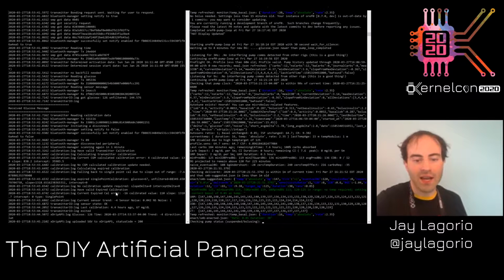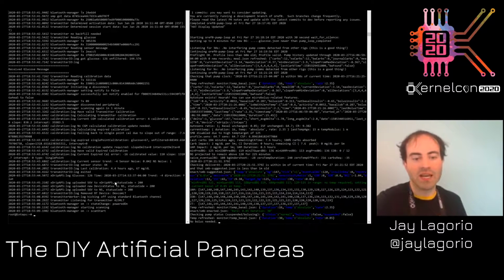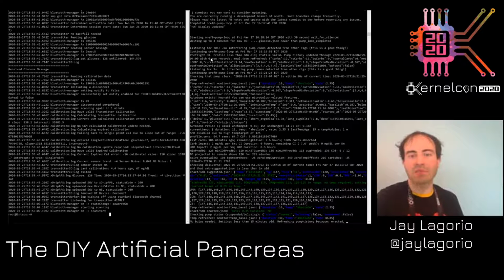And then right about here, uploading it to OpenAPS and to Nightscout at the same time, and then waiting for another connection. What's going on over here is it does a ping, so to speak, to make sure that the pump can be communicated with. It checks to see if anything new has happened. And then it sees that it's received a new blood glucose value. So it's going to kick off all of this stuff to measure what's been going on and predict, that's down here, what will happen in the future.